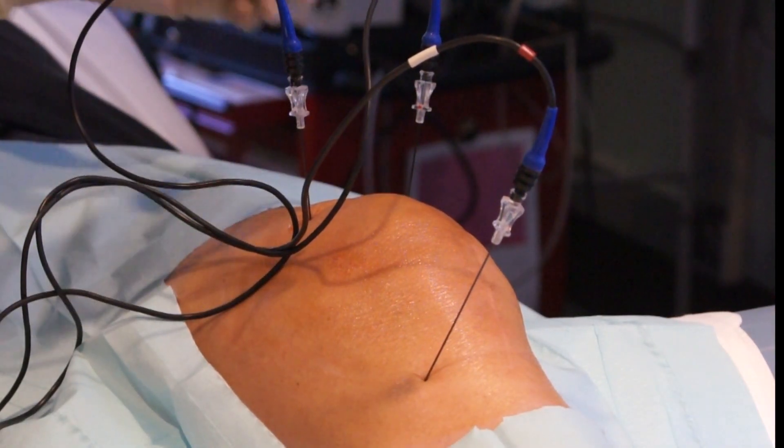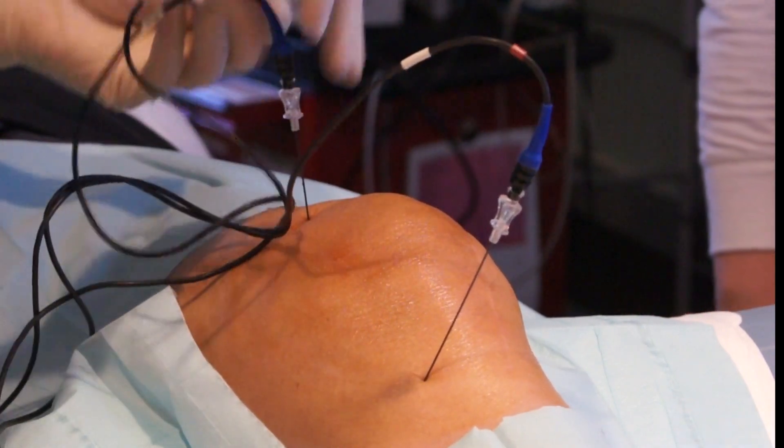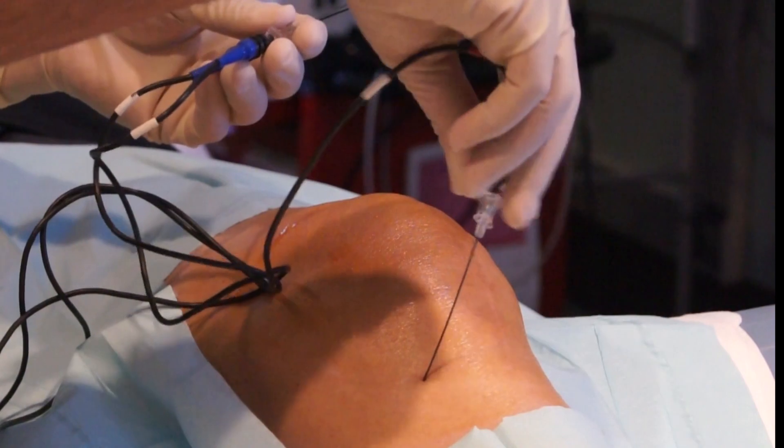We are now done. We are pulling the needle out. The patient tolerated the procedure very well. Thank you.